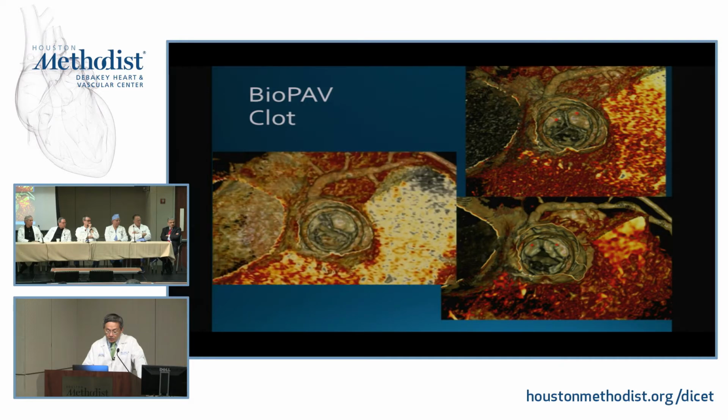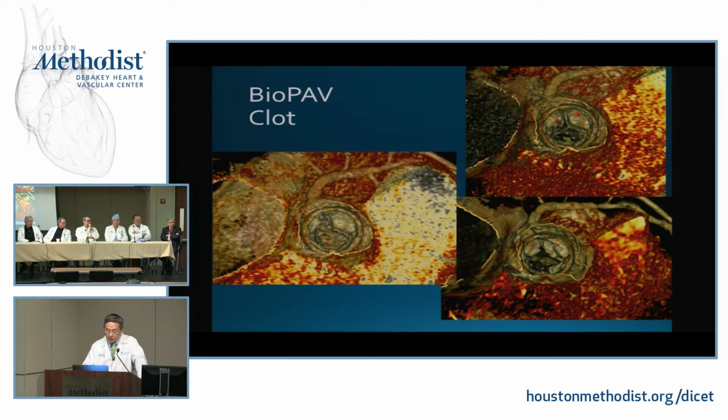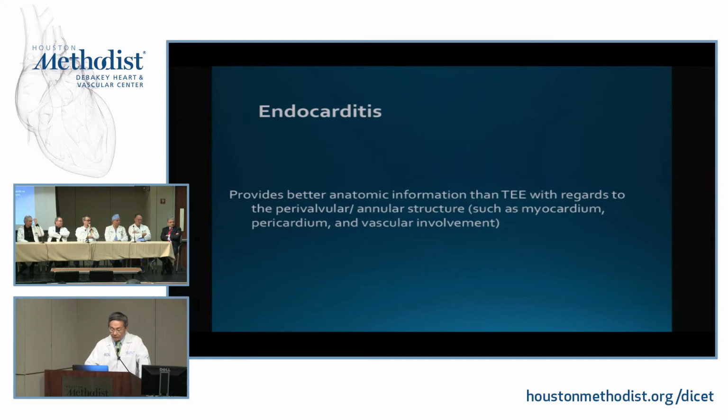A patient with a biological valve with clot in 2 of the coronary sinuses, very nicely seen in this 4D and 3D rendering of the aortic valve.